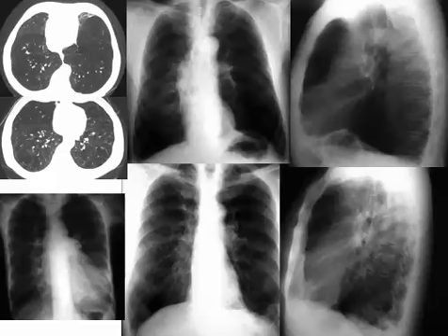signs. A nice sign also is the angiographic appearance of the aorta in the lateral film in case of emphysema, the accentuated density of the aorta. This is a nice sign which can sometimes be mentioned. And of course we said about complications, mainly pulmonary. Bronchitis could be associated.